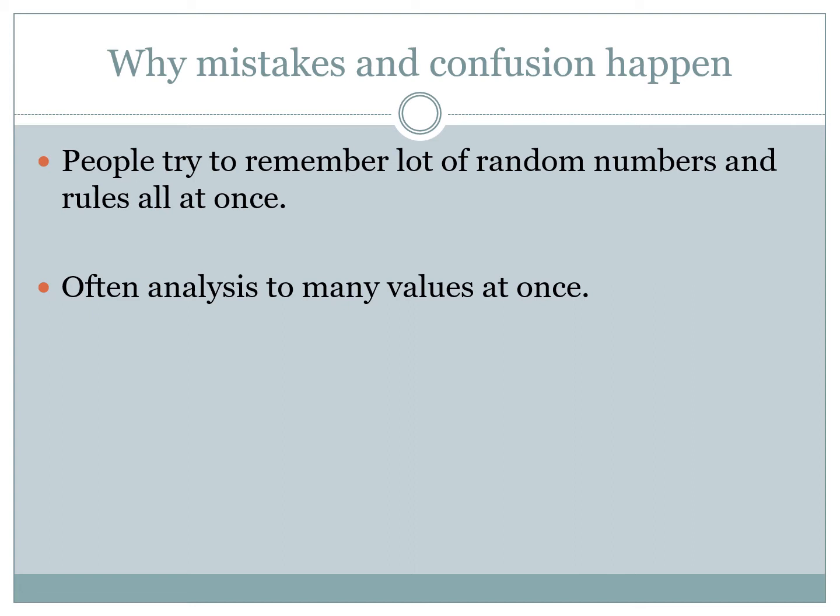So when you look at a simple blood gas analysis, the reason a lot of people go wrong initially is because they don't have a methodical approach. They essentially get the printout, they're confronted with all the numbers, and they try to remember all the random rules they've been taught before. They try to incorporate all the different cations or anions because they heard somewhere that they were important, and they get overwhelmed. They try to analyze too much.